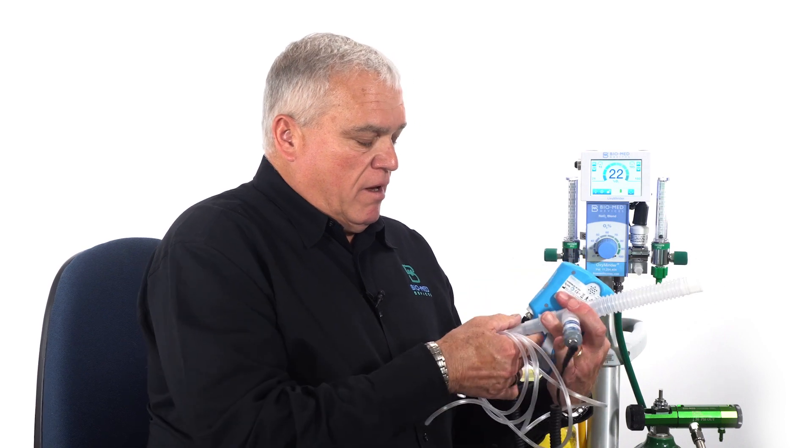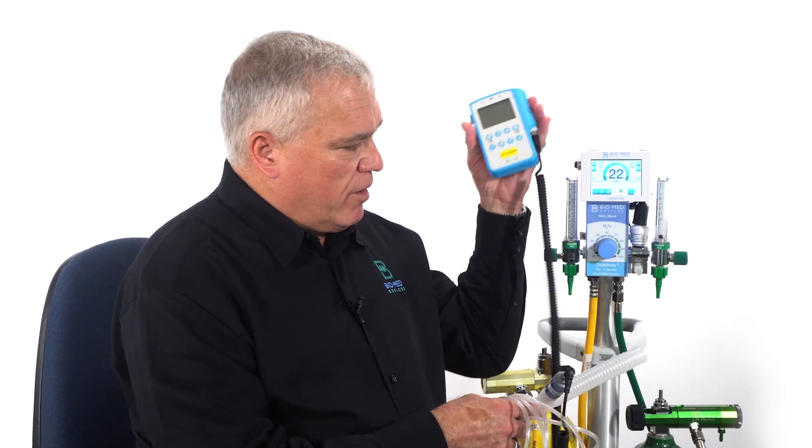In order to do that, it's a very cumbersome process. Normally, you have to get some oxygen tubing, a little adapter, get an oxygen T, a little reservoir, and connect your analyzer, and then figure out a way where to put it.